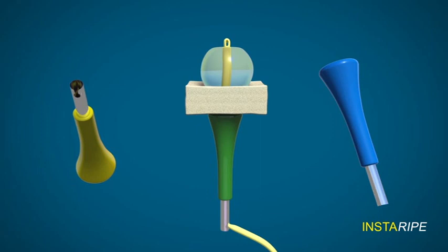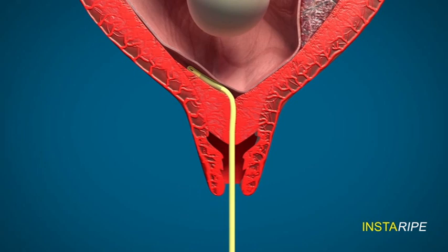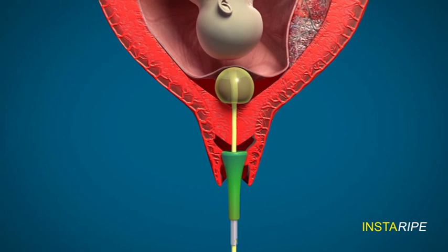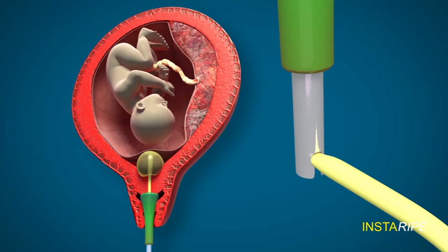The sponge here represents the cervix. The Foley is introduced into the extra amniotic space like this and then the bulb is inflated with 70 ml of saline and pulled down. The cervical ripening device is introduced through the vagina to press on the cervix like this and the Foley's catheter is pulled down with force and fixed onto the side hole of the ripening device like this.